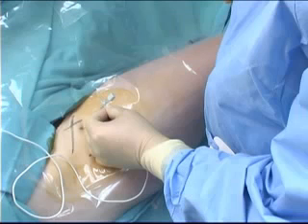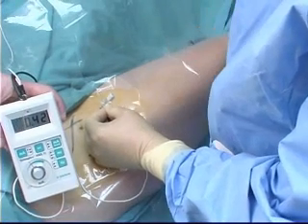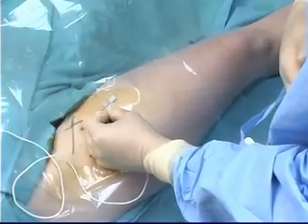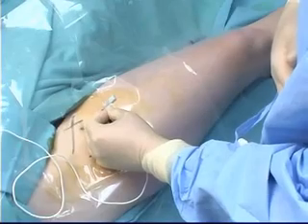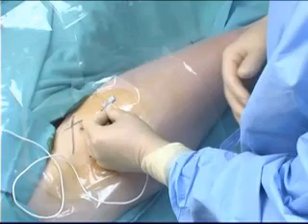The notion of opening up the space with normal saline to advance the catheter is not based on scientific fact, since in live tissue it only infiltrates the tissue, makes it edematous, and makes further nerve stimulation impossible or very difficult. This recording shows perfect quadriceps contractions at a nerve stimulation output setting of 0.42 milliamps. The needle is now perfectly placed.